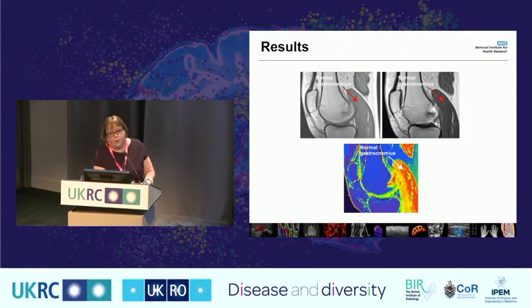With T1, we get to see the whole knee. So not only do we get to see synovitis, we get to see other structures as well. And this is my good friend, the gastrocnemius. And so I took a lot of images of the gastrocnemius, and we can see what's happening within the gastrocnemius. And it's been proven that patients with osteoarthritis of their knee have really poor quads and they have really bad gastrocnemiuses as well.